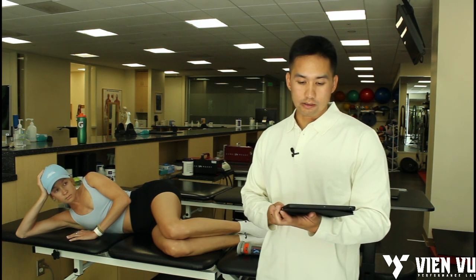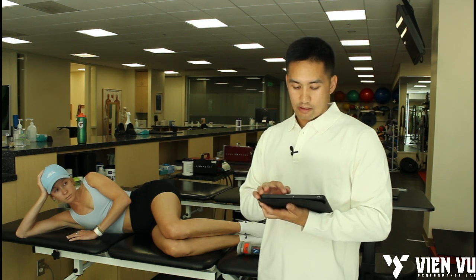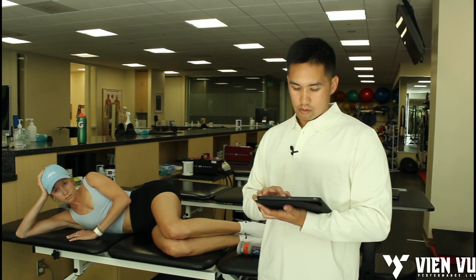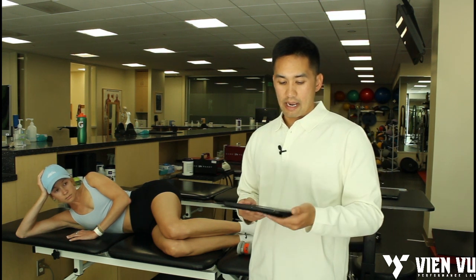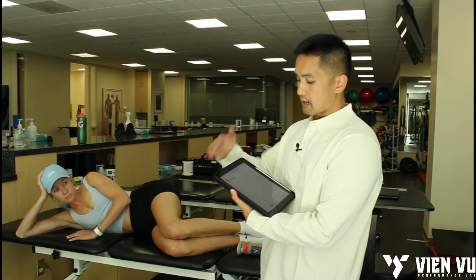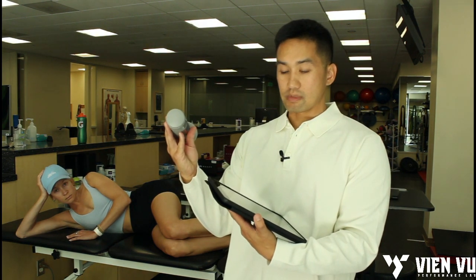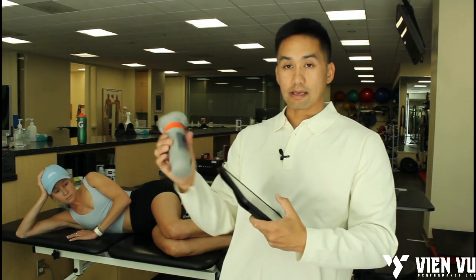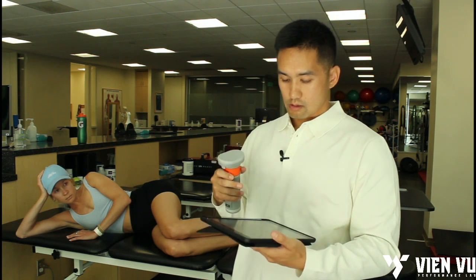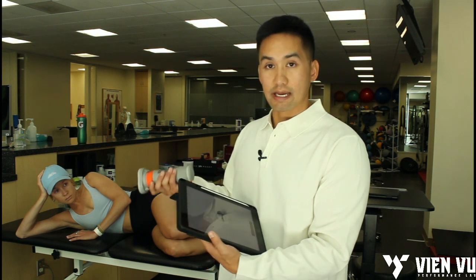I logged on to the Valve Dynamo app and I'm going to connect to the Wi-Fi right now. I open the app, push Sync Devices, found my Dynamo really quickly, and it identifies which pads I have. I'm using the Palm Pad because that's going to help me be a little less painful, and the Curve Pad which is going to be more comfortable for the patient. It connects and syncs up pretty quick.